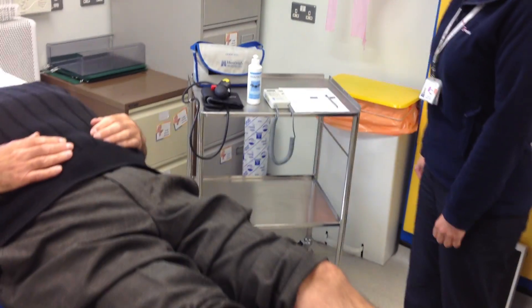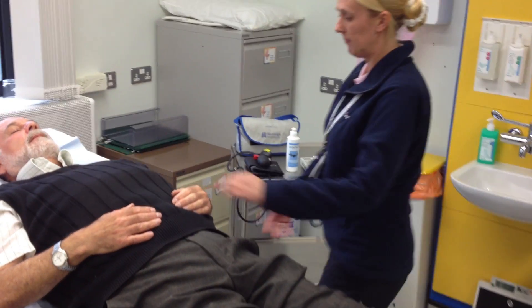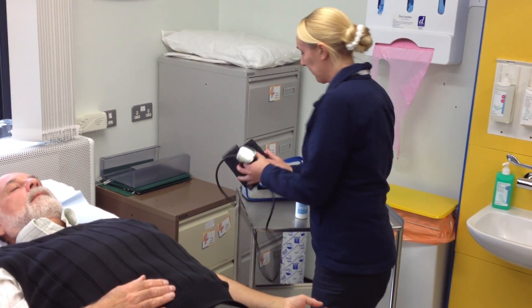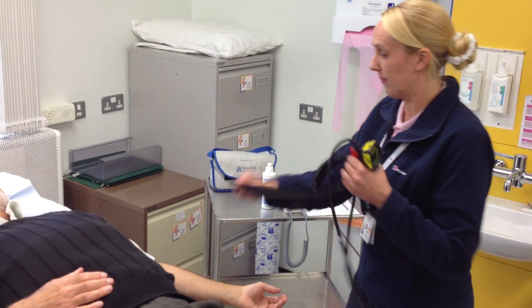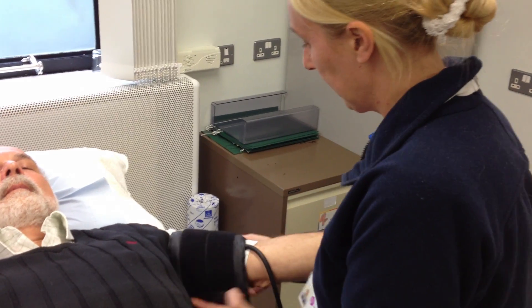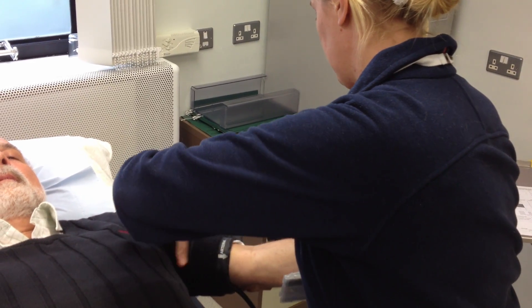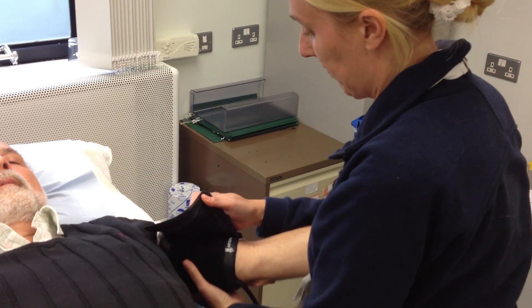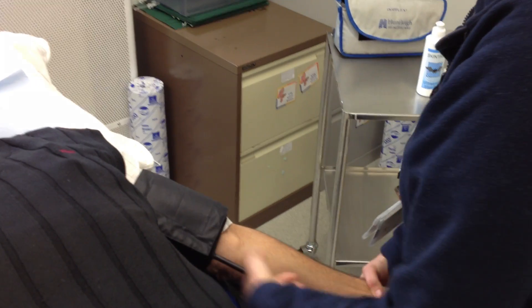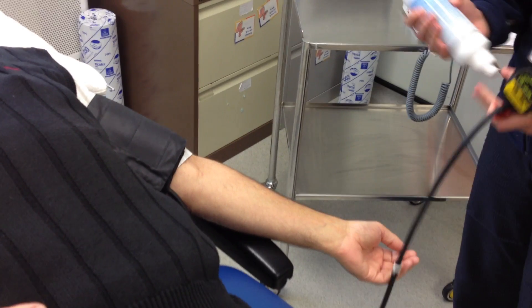The patient for this examination is lying flat and has been rested for a few minutes. The blood pressure cuff is placed around the patient's upper arm, about 2cm gap between the elbow crease and the bottom of the cuff, wrapped in a parallel fashion around the arm. The arm is kept to the patient's side at the same height as the heart.